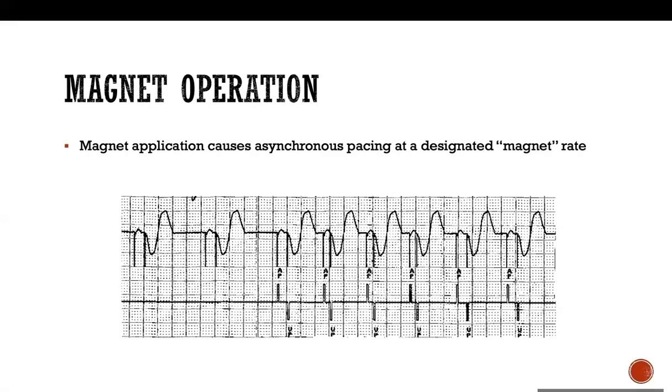Okay. So we're talking about someone called you from a surgical team. They're telling you they need to take this patient to the OR. He has a pacemaker. Advise us what to do. First of all, we should call the company for the magnet operation to adjust the heart rate, and to minimize the rate of the, if there is any ablation or anything, to minimize the time. We'll fix the heart rate regarding the atrium and regarding the ventricle. It will depend totally on the pacemaker, will not depend on the sensing at the OR.